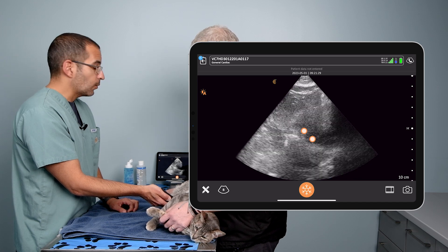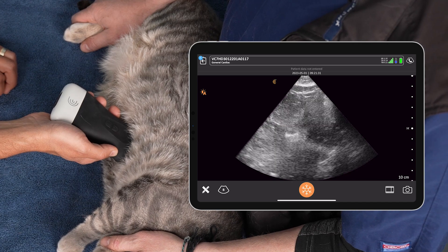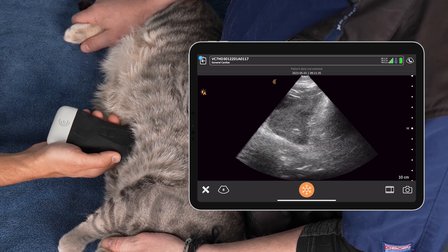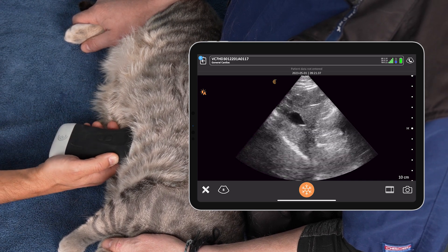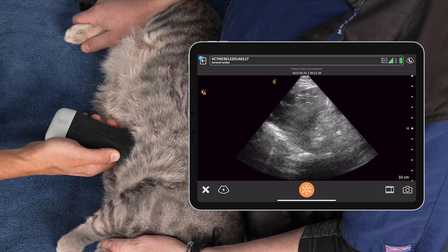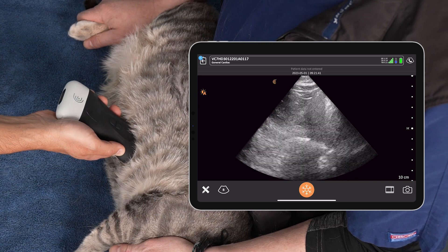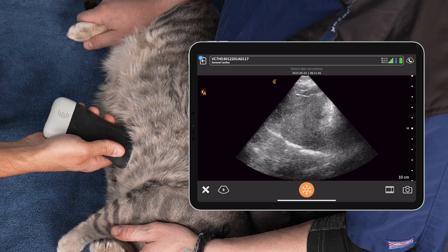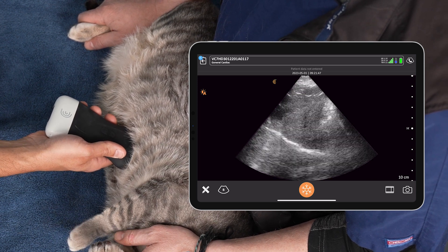So the first question we're going to ask is: is there free fluid at this site, yes or no? We're longitudinal. How do we look for that free fluid and rule that in or out with confidence? We're going to fan that probe on either side of the liver until the liver disappears on both sides, to be able to say with confidence that there's no free fluid. Excellent — so that's one question we've asked and answered.